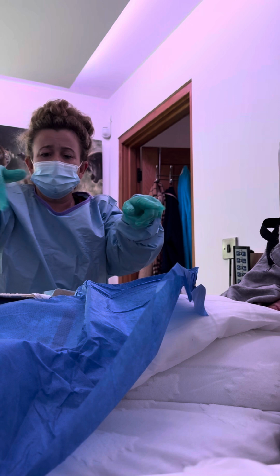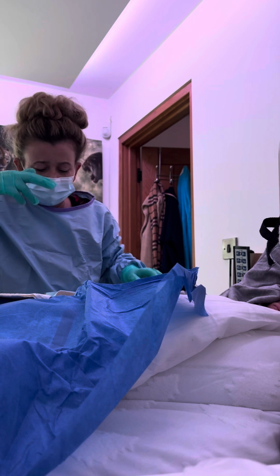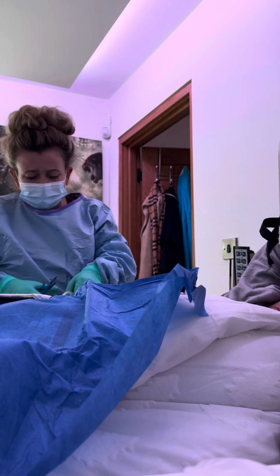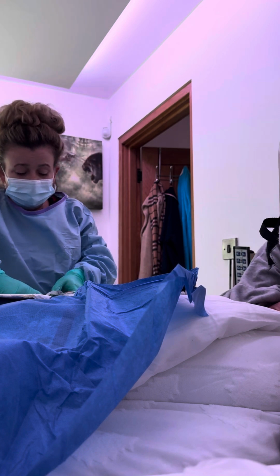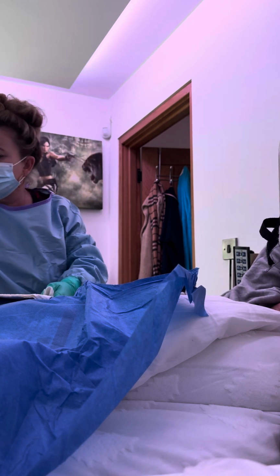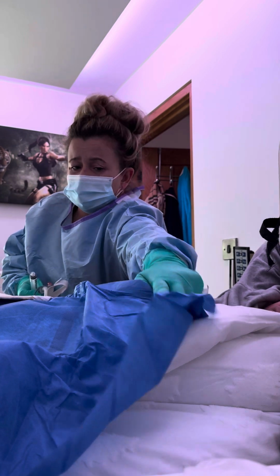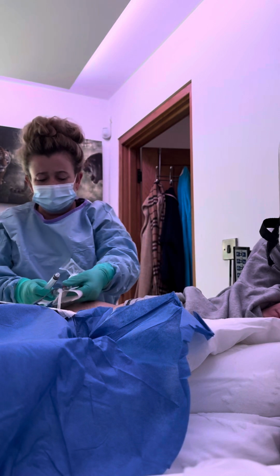So obviously here is all sterilised, the whole lot is sterilised, but this is a dirty area at the moment, what we class as a dirty area. So what I'm going to do is I've got the clamps, and I'm going to clamp the catheter just to this pad, just so I don't mess with it and it doesn't drag. While I do this deflation, here we go. There's the empty syringe. So pop it into the nozzle. I'm not even sure if you can see on that video. I don't need that sterilised, I just need that sterilised pack there.